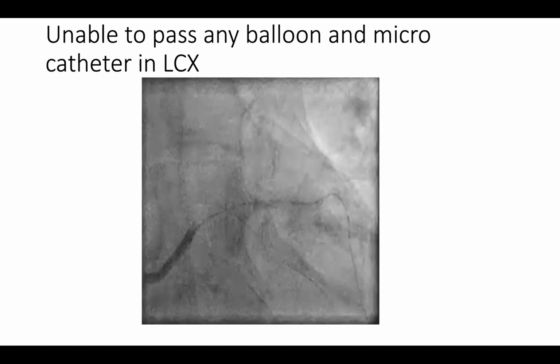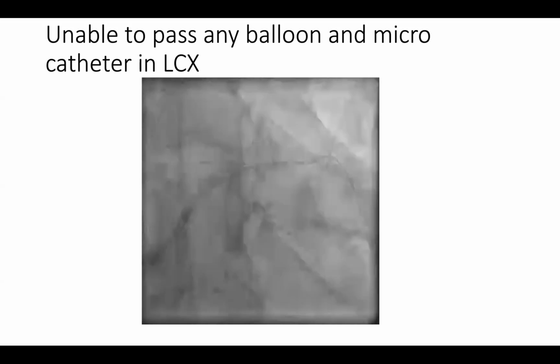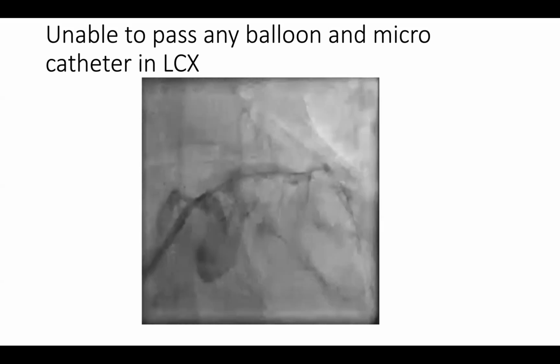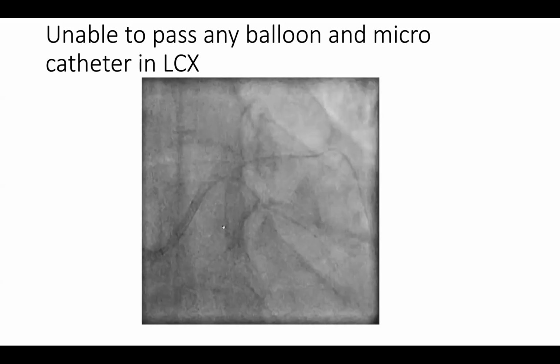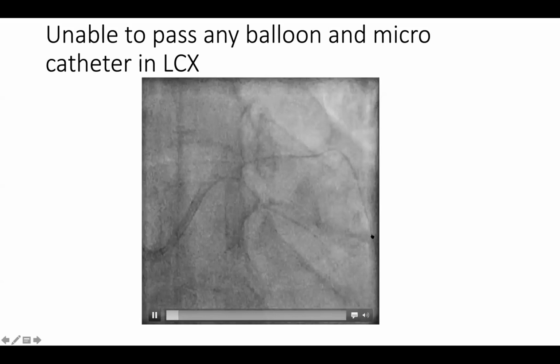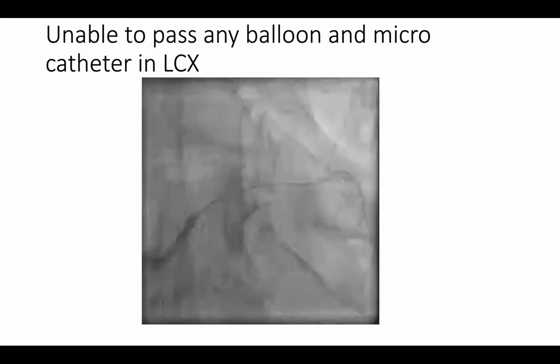Yeah, at that time, we asked some other consultant who is more expert in laser and asked for help, and he is around, and we are preparing for laser actually. But still, we are not sure whether laser can sort this tortuosity and bend and calcification or not. Well, laser is indicated in this sort of case, but actually it's moderate calcification on the label. So the question is, are you calling this moderate calcification or severe calcification?